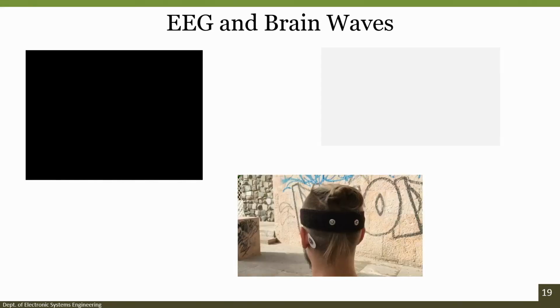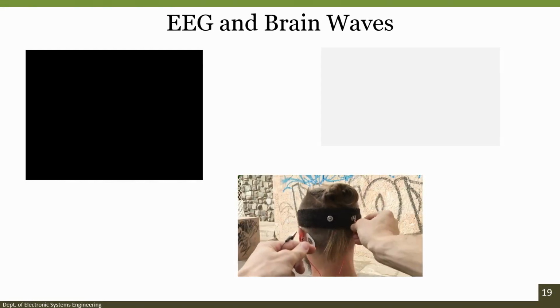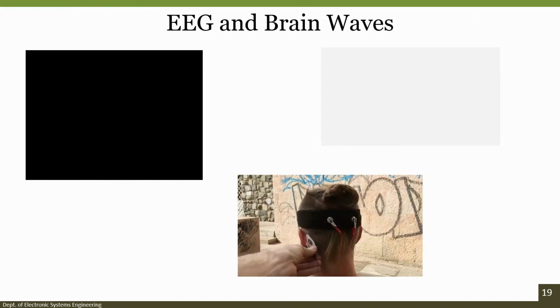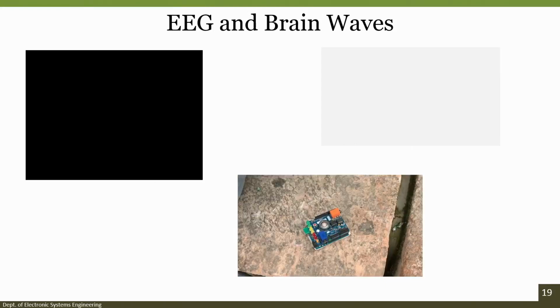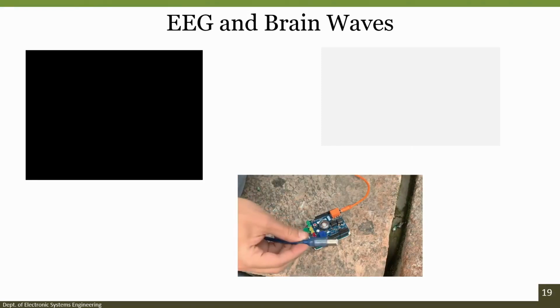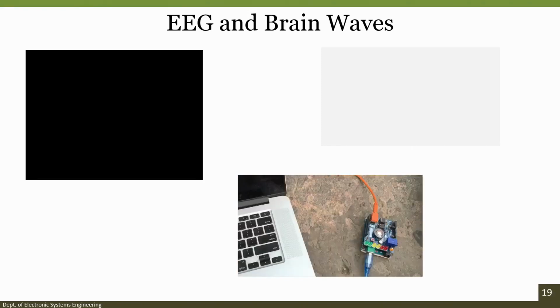of the signal. With your orange interface cable, attach the red alligator clips to the electrodes on the back of the head, which is which does not matter, and the black alligator clip to the ground behind the ear. We then plug the orange cable into the orange port on the heart and brain spiker shield and the USB cable on the other side. The other end of the USB cable goes into the computer, and we are ready to begin.